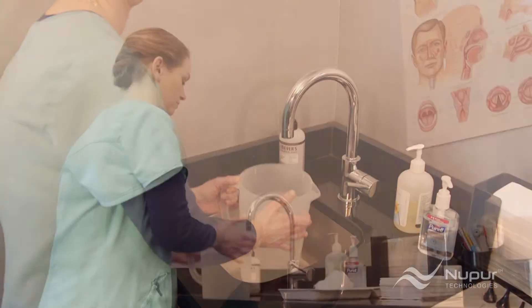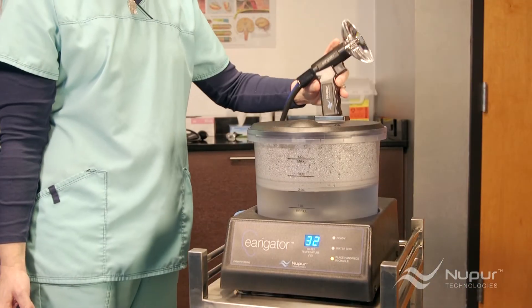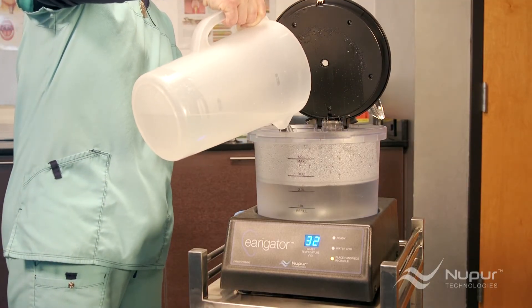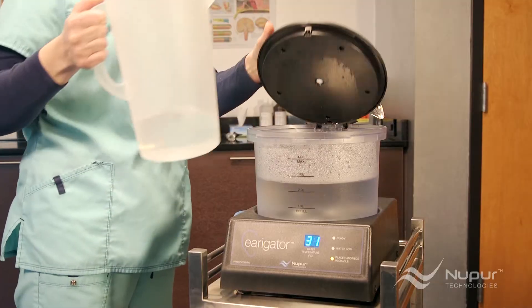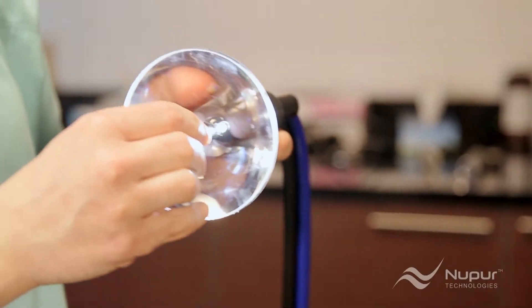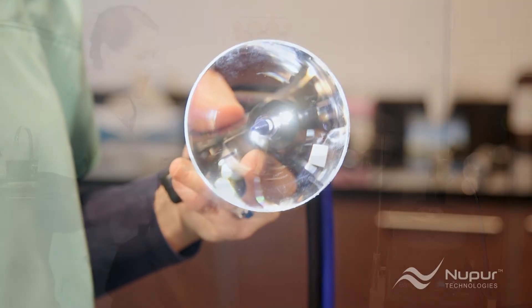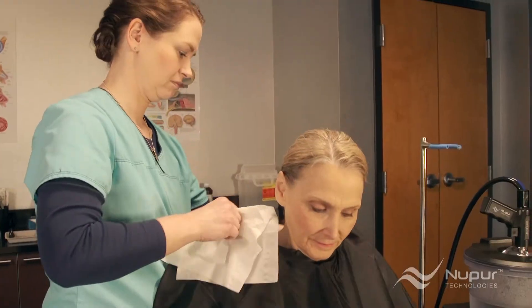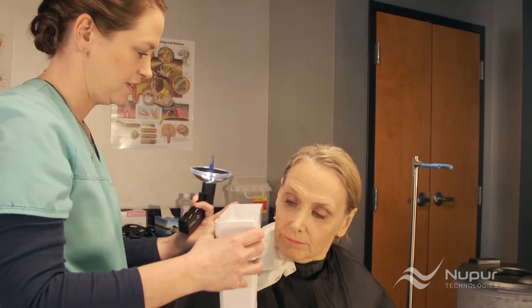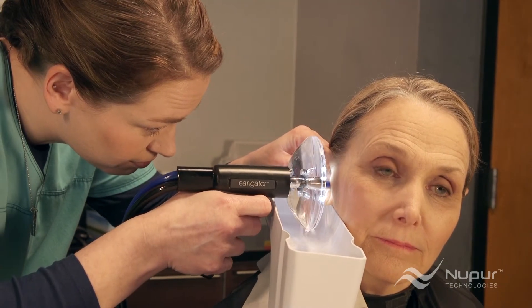Once you've established that the patient is a good candidate for irrigation, you can get the irrigator ready to use. Note: only use cool to room temperature water — no hot water. Normal tap water is fine. Rachel next attaches a one-time-use disposable nozzle; an easy quarter turn locks it in place. Don't over-tighten. Although it's not necessary, you may want to drape patients to prevent water splash from getting onto their clothes. Next, instruct the patient on how to hold the custom-designed catch basin. Place the basin directly under the earlobe, about midway along the shallow section of the basin, tipping it slightly forward.